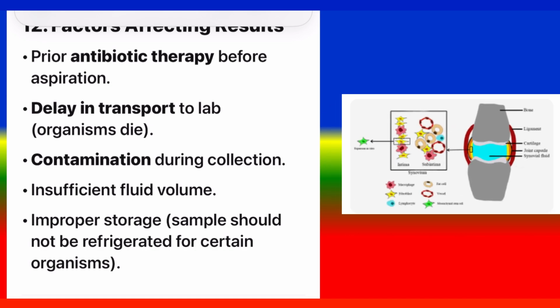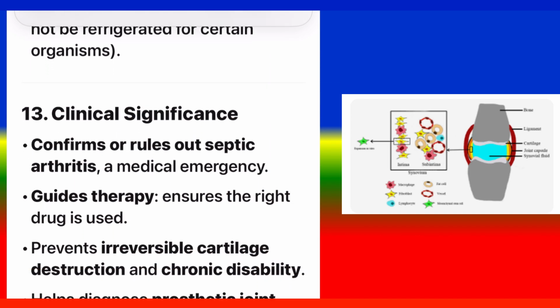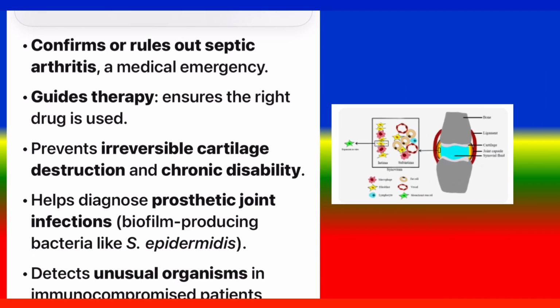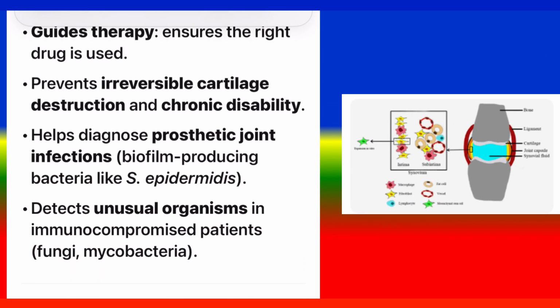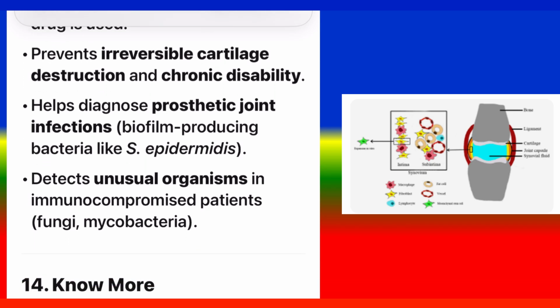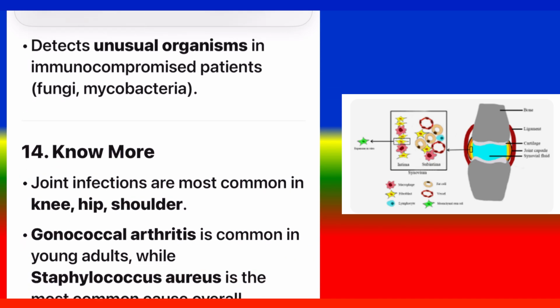13. Clinical significance. It confirms or rules out septic arthritis, a medical emergency, guides therapy, ensures the right drug is used, prevents irreversible cartilage destruction and chronic disability, helps diagnose prosthetic joint infections, biofilm-producing bacteria like S. epidermidis, and detects unusual organisms in immunocompromised patients, fungi, mycobacteria.